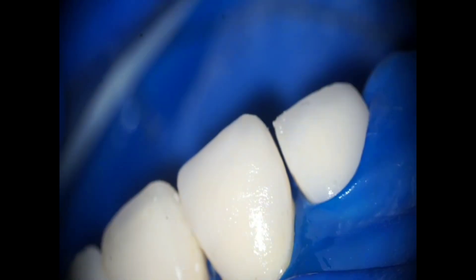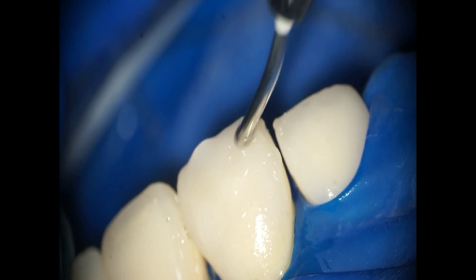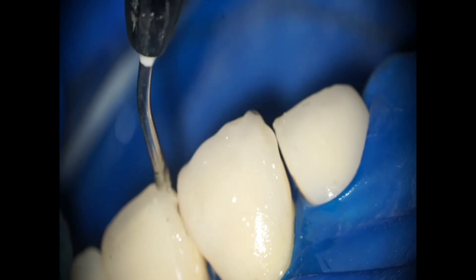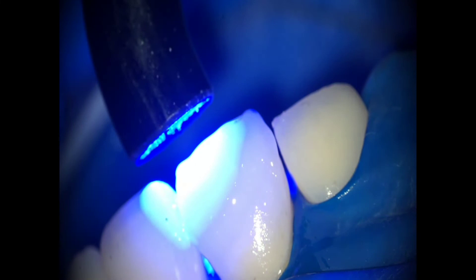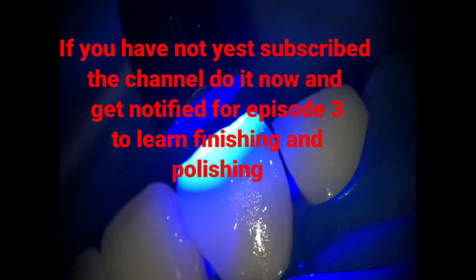The video is at a slightly higher speed to reduce the video length. Light cure all around — 20 to 22 seconds — buccal and palatal. Now apply the glycerin jelly to prevent oxygen inhibition all over the composite you have done. Finishing and polishing will be explained in episode 3.